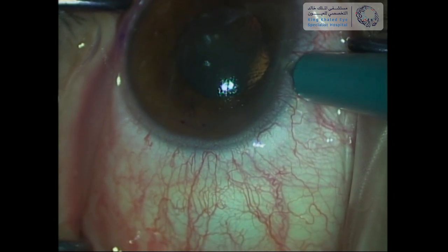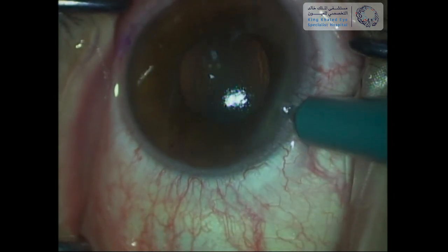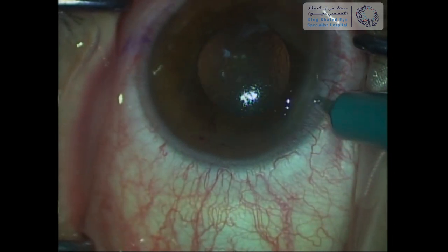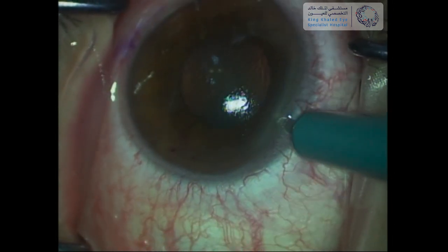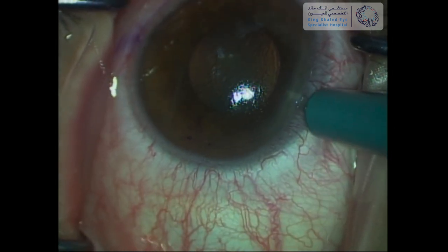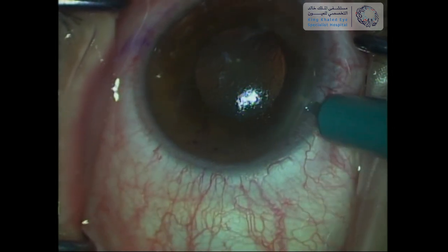The surgery is started with a paracentesis using a super sharp blade. Here I am only doing one side port, but in the case of an office surgeon, two side ports will make future manipulation much easier.